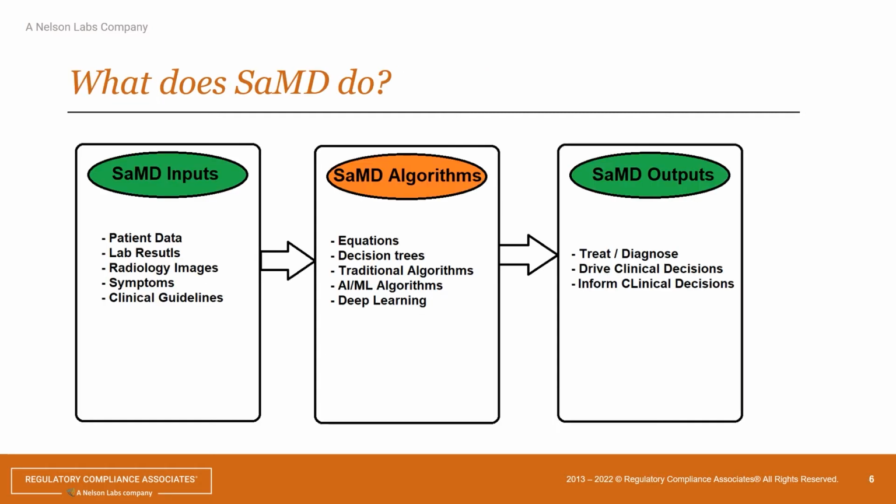So what do SaMDs do anyway? This is a generic pattern for SaMDs. It usually takes in some input that is either patient data, lab results, or images coming in from CT scans, x-rays, etc. Maybe you get some information from the patients through a questionnaire about their symptoms, or it uses clinical guidelines that have been developed by clinicians.